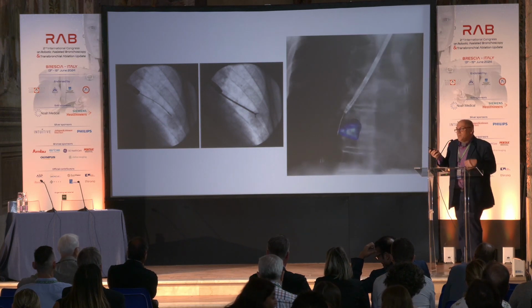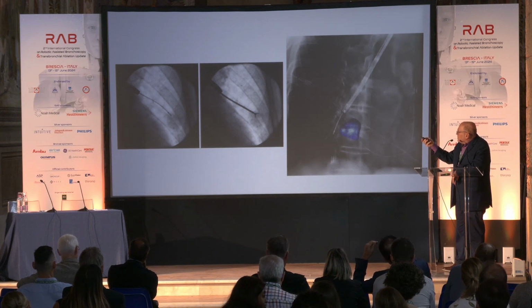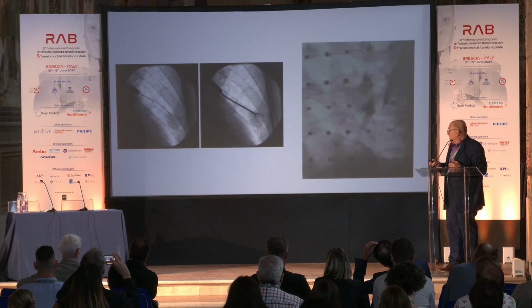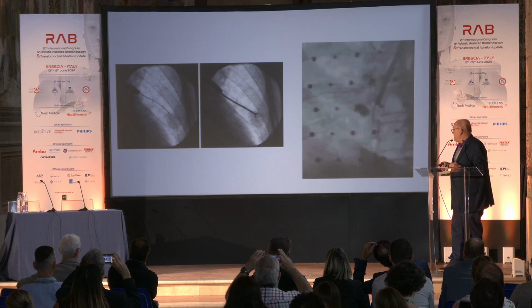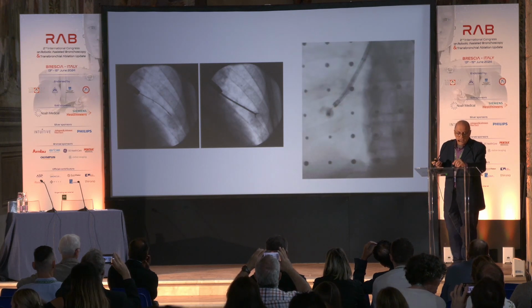So anyway, even though you may look like you're in the lesion in 2D fluoro, when you go out of plane into an oblique view, you obviously are not. Again, you could see this illustrated by this video here. I hope the sunlight doesn't wash this out too much, but you could probably see it better on the monitors.